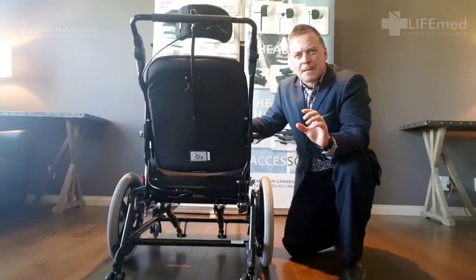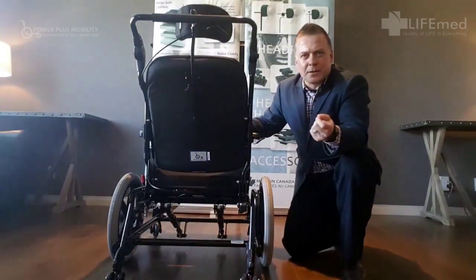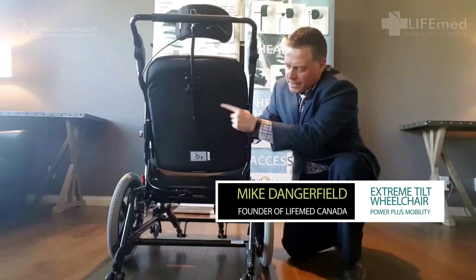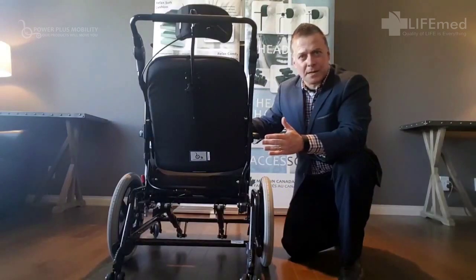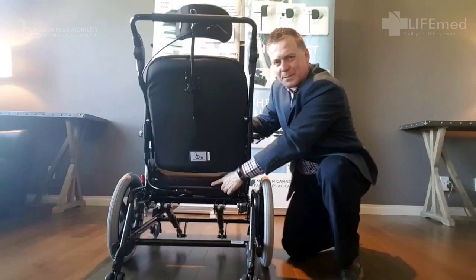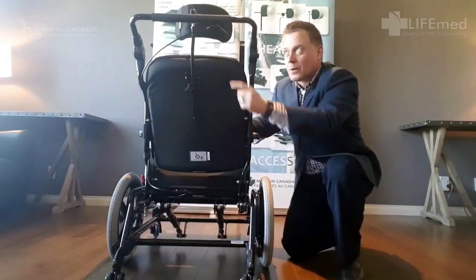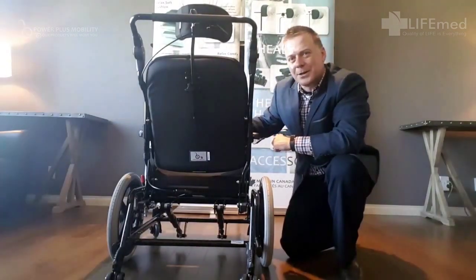I'd like to point out a design that Power Plus has come up with that's been able to overcome a serious issue in seating clinics. They have this option called endomorph back canes, where there's a one inch flare on each side. Some of our clients are broad in the shoulders but narrow in the hips, so with the endomorph back canes we can actually put a 20 inch backrest on an 18 inch seat pan. We could also do the opposite — for somebody who's narrow in the shoulders and wider in the hips, we could rotate them inward and put a 16 inch backrest on an 18 inch wide chair.